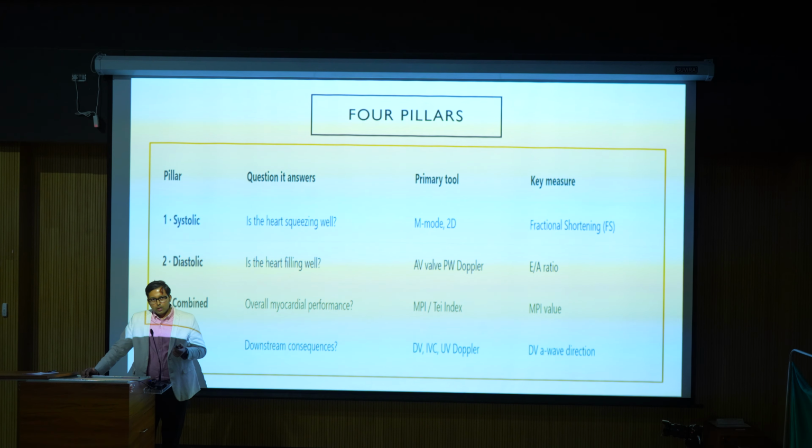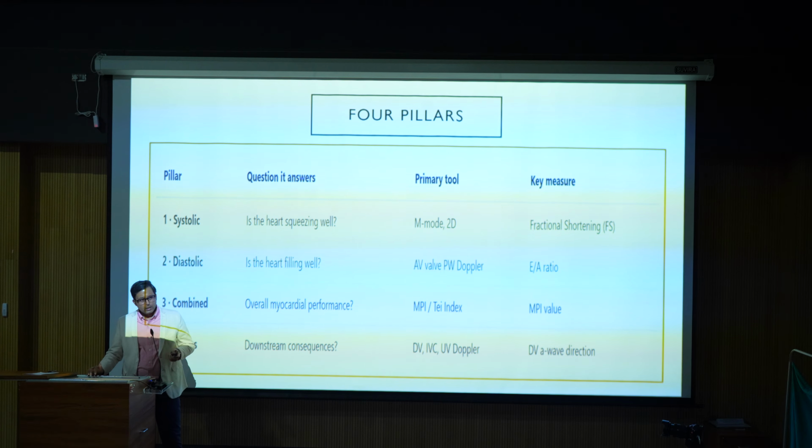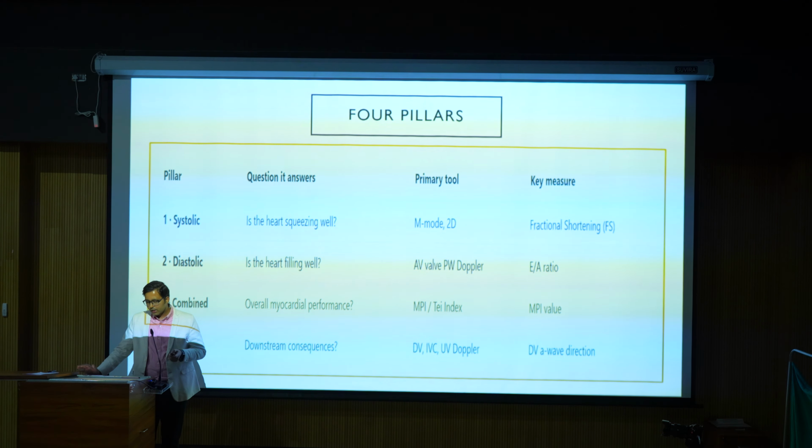Third, the combined assessment of the fetal heart is about the overall myocardial performance, which will be calculated with the help of the myocardial performance index, or the Tei index. And based on the MPI values, we can tell whether the global functional assessment of the heart is good or not.